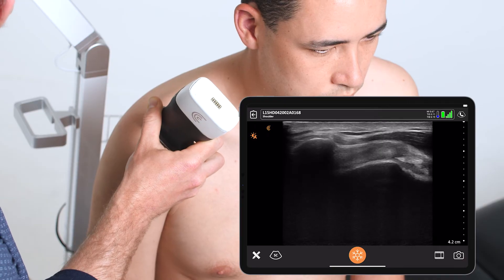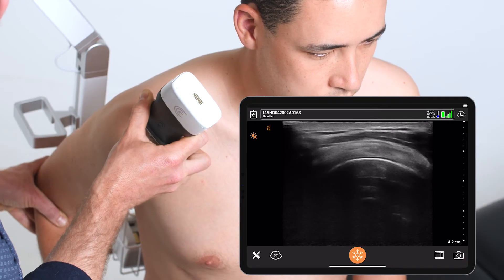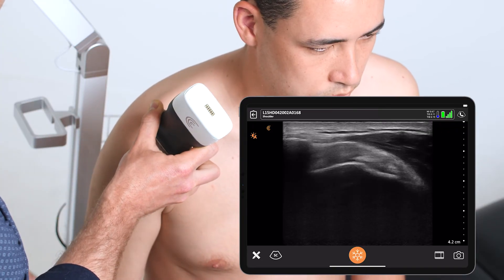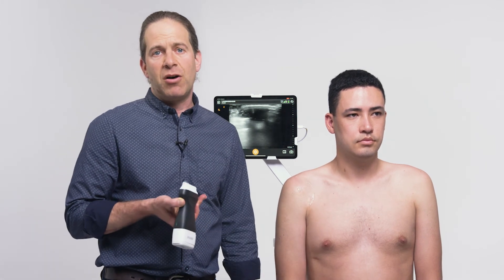In dynamic motion with the tendon in view, I can take their arm back and forth through the full range of motion looking for any signs of impingement. As we can see in this patient, there was no obvious pathology identified.